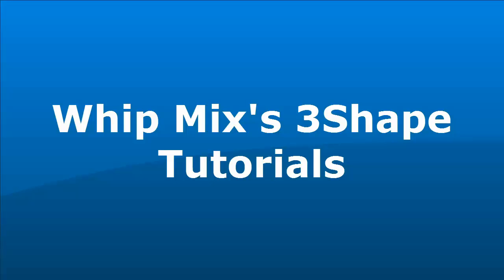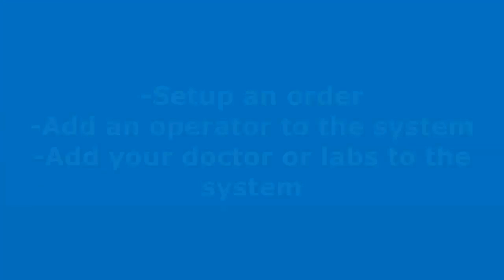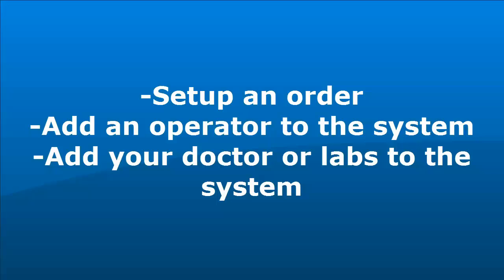Welcome to Witmix's free 3Shape tutorials. Today we're going to be covering how to set up an order, add an operator to the system, and add your doctors or labs to the system.